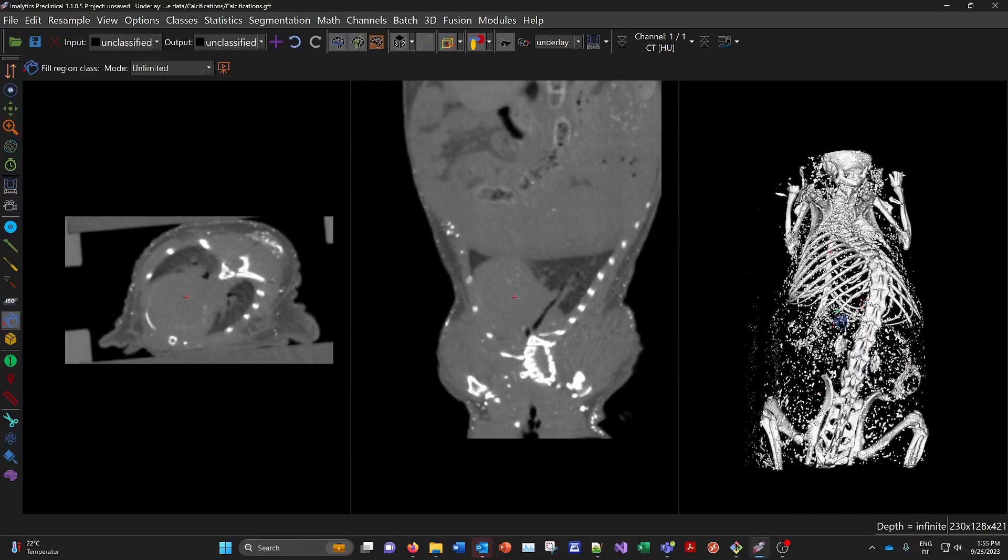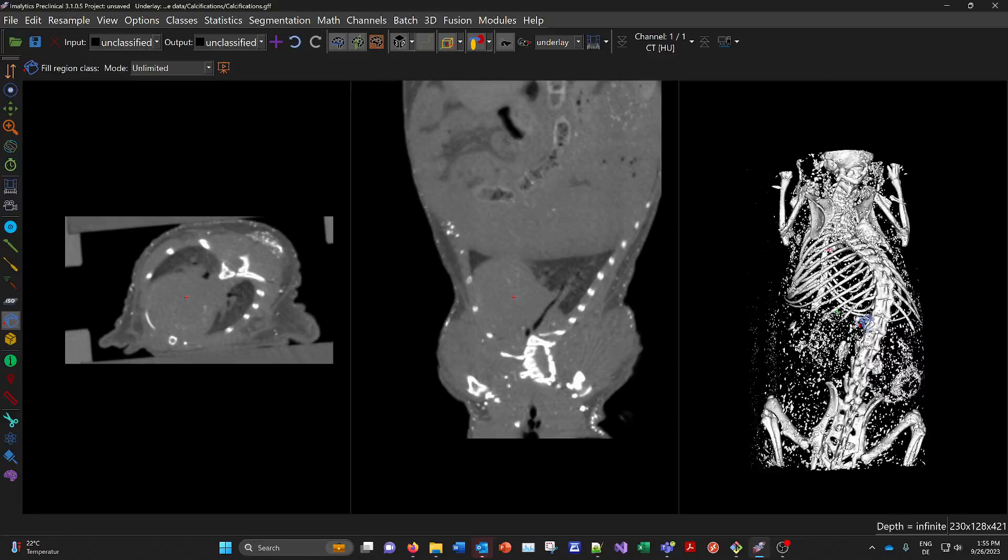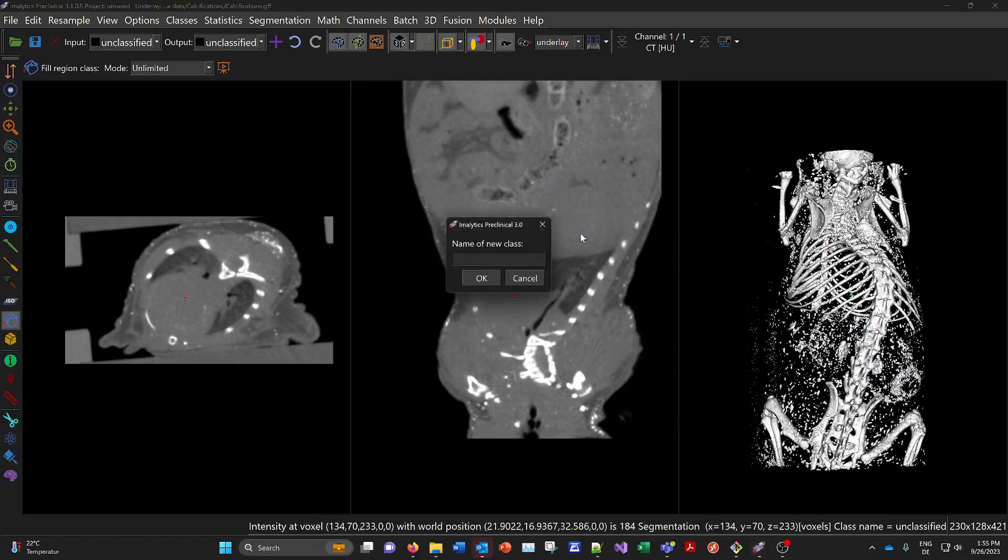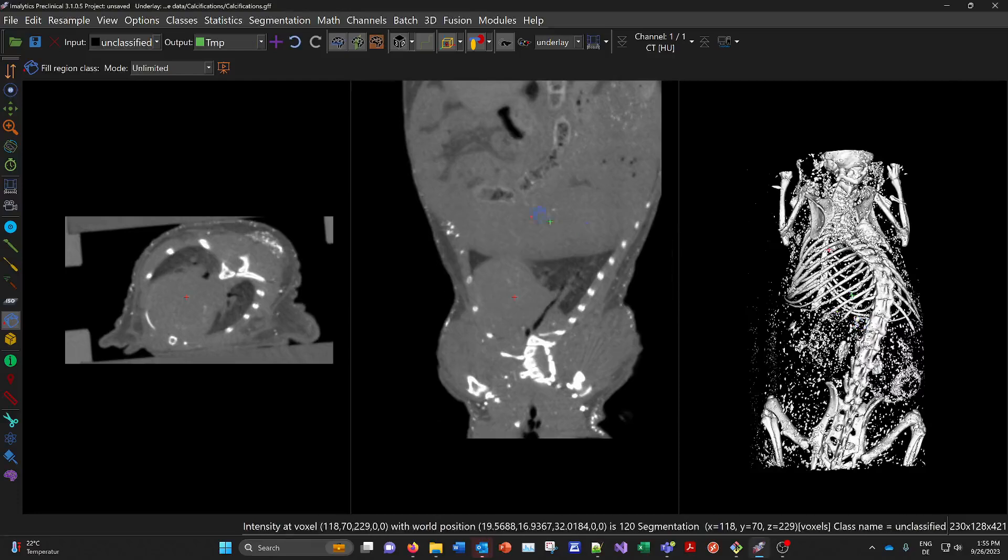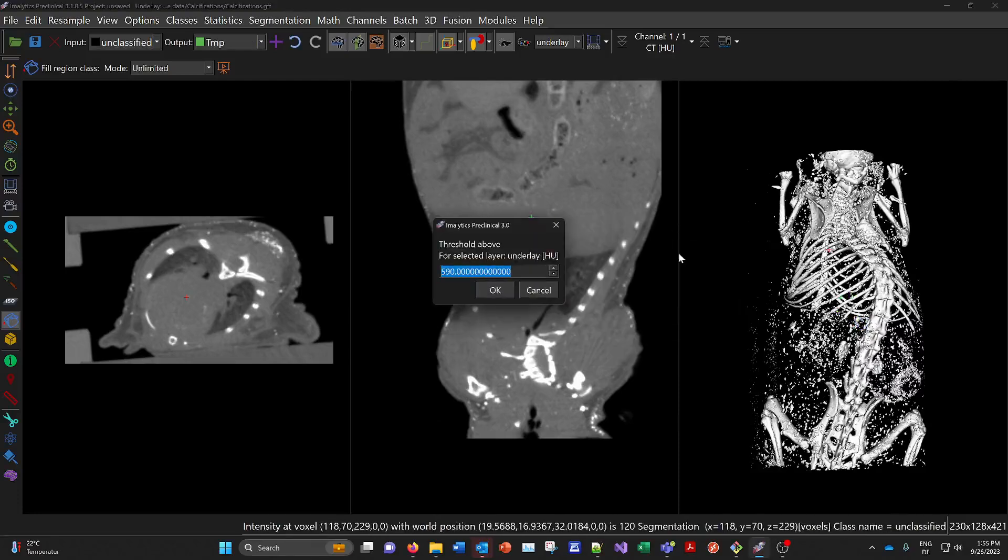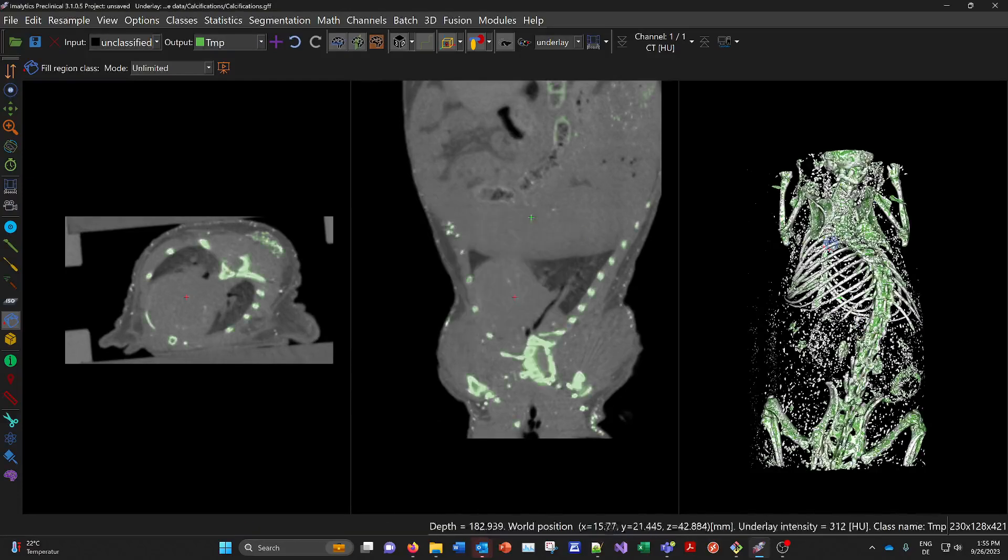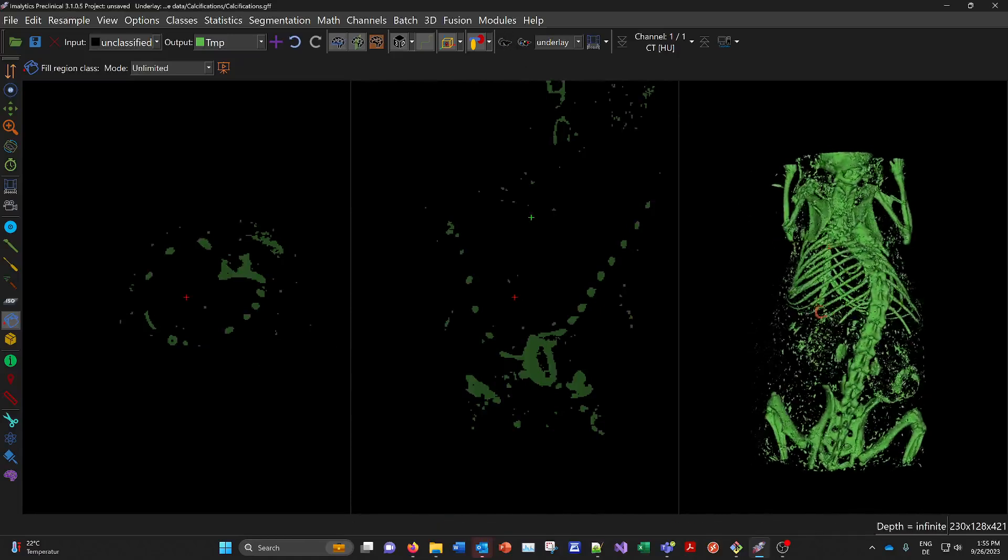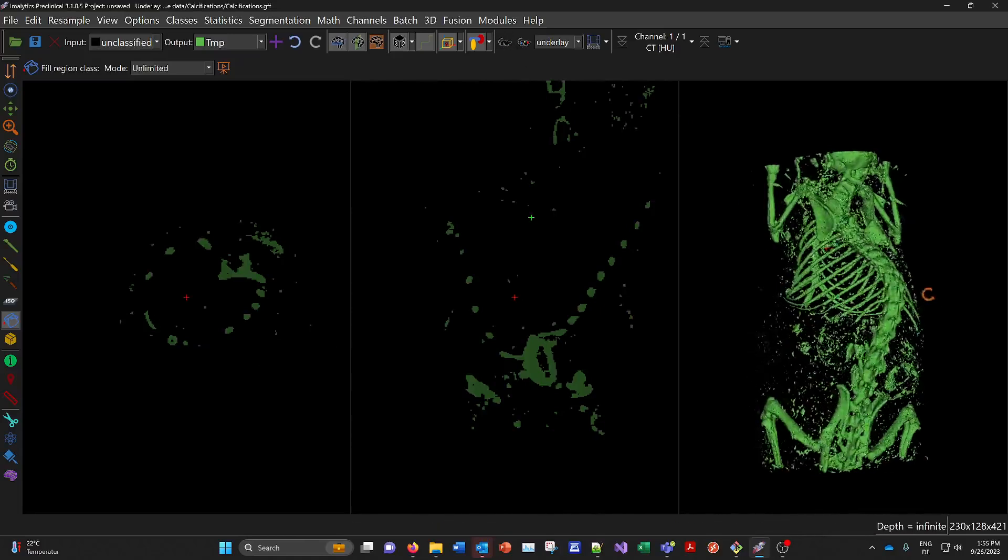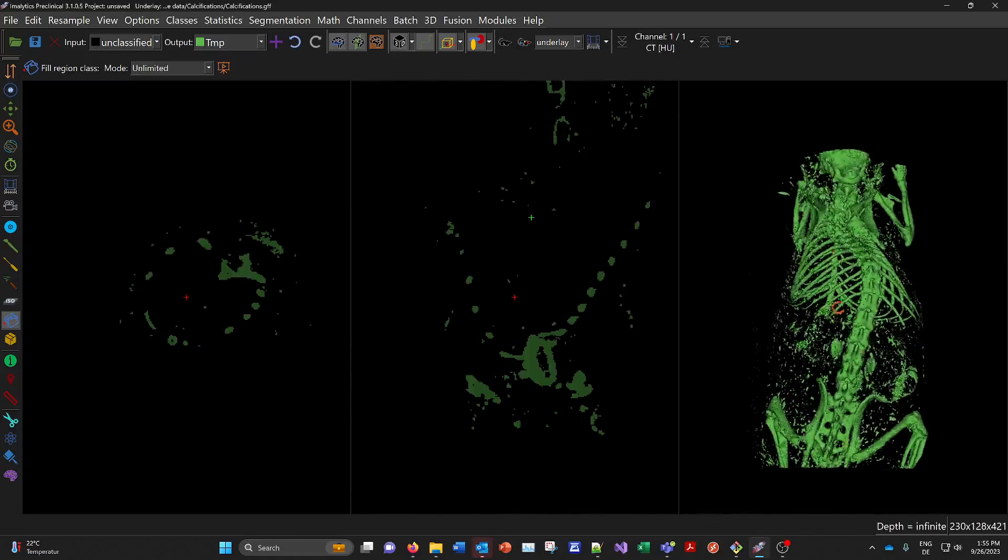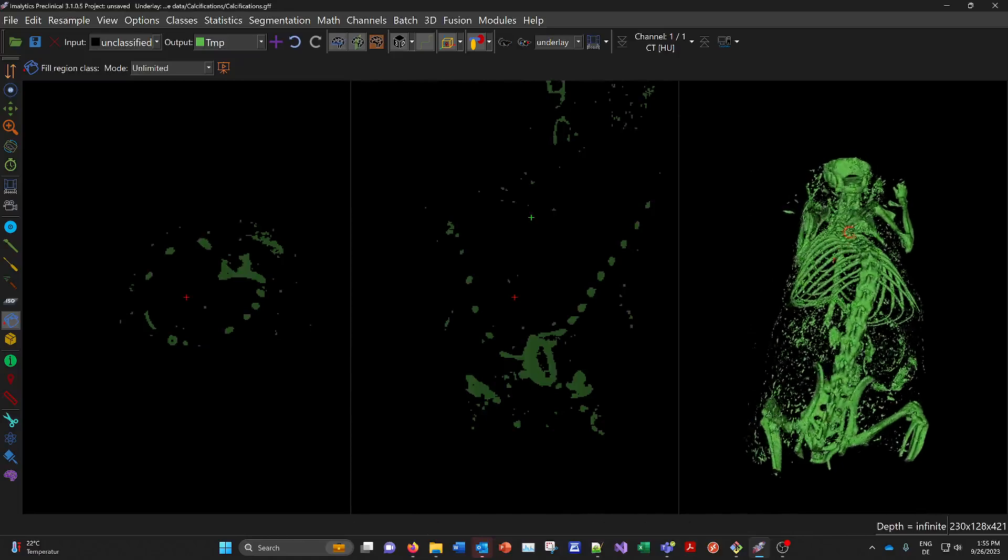Okay, so let's do a thresholding operation. So we add a temp class. Then do a thresholding above maybe 400 Hounsfield units. And now I can hide the underlay, the CT. And now I see a lot of calcifications here in 3D.